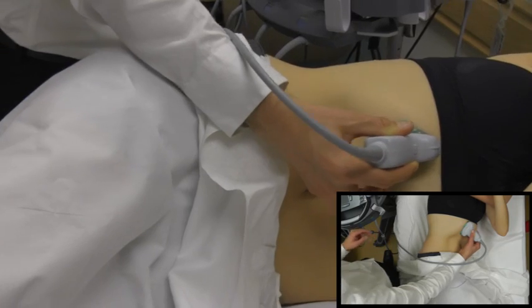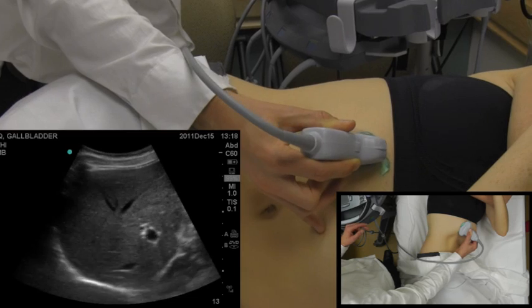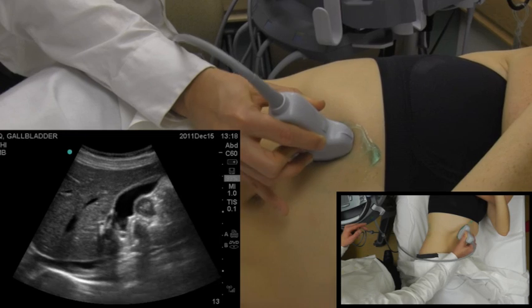As you place it pretty close to midline, you can see that the gallbladder is right here. To get a better picture of the gallbladder, you can have them take a deep breath in — that pulls the gallbladder down even more, and you can see a nice big gallbladder here.